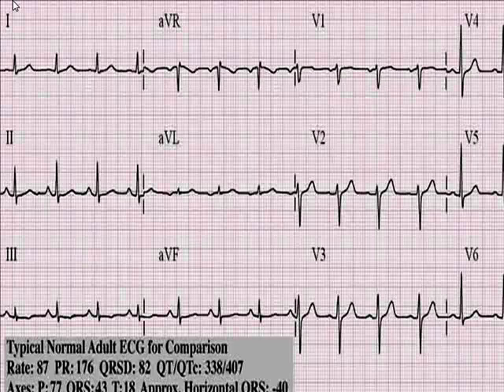Let's say this is one person, and this is another person, and this another person. All of them are seeing the heart from different views. This is from the front, this is from the lateral, this is from behind, this is from inferior. All of them are seeing the heart with their eyes. Just imagine this, and every one of them is telling you what he is seeing. If there is any problem, he will tell you there is a problem.